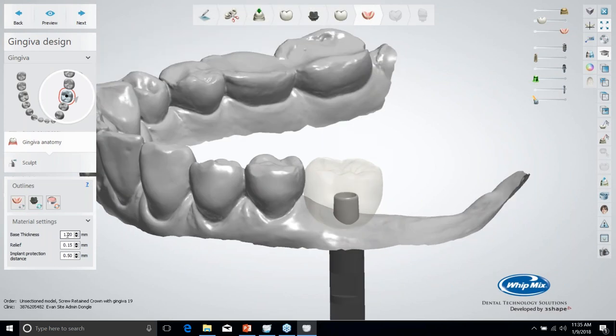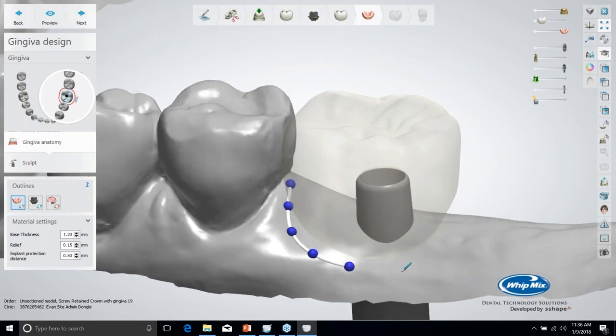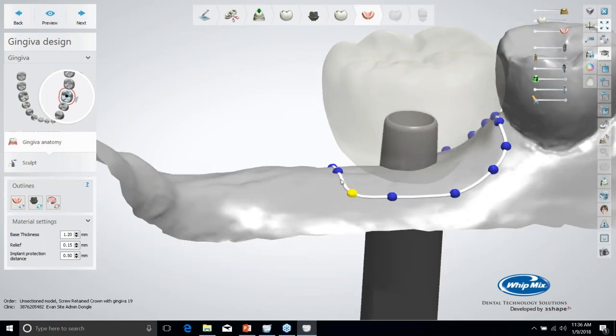The base thickness is how thick it tries to make this tissue when it applies it. Relief would be how thick the relief wax is going to be if you put relief in there. And then implant protection distance is how far from this circle outwards it protects that implant. So we'll go ahead and click on draw artificial gingiva. And then we're going to come in and start drawing our outline, just by single left clicking, and then finish by clicking the first point. Now that I've finished the circle, I can drag and adjust this.